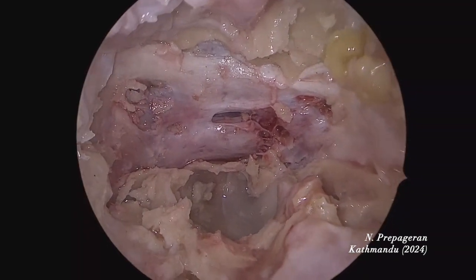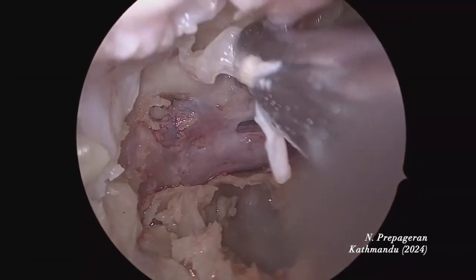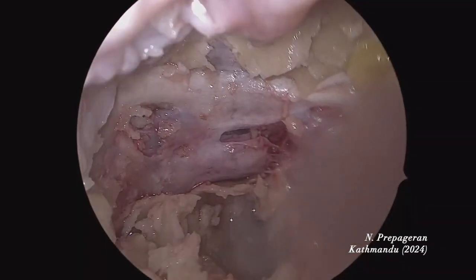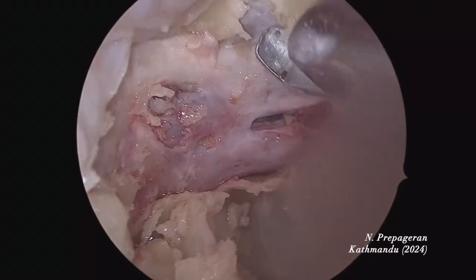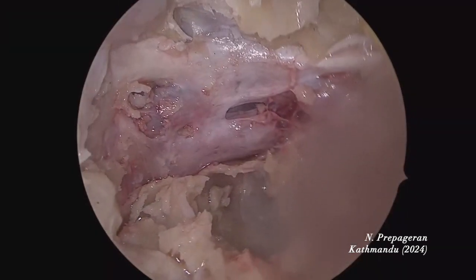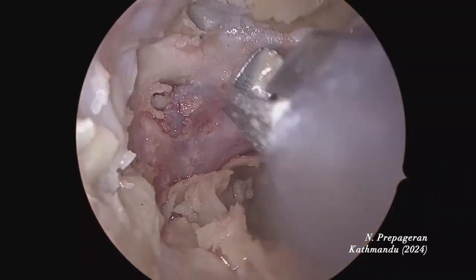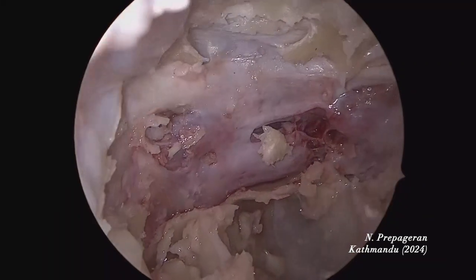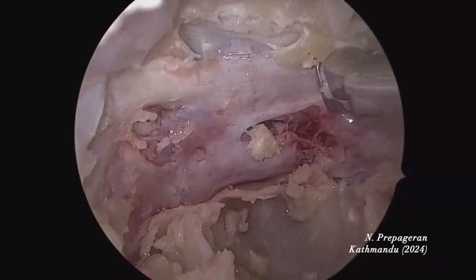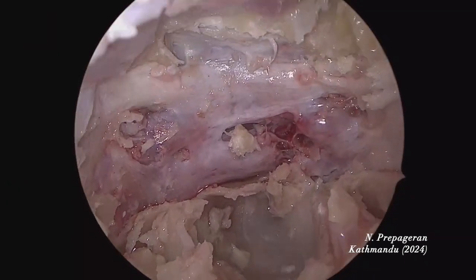Let's go up and expose the planum a little bit more. This is the easiest part. The only issue with planum is it's a sloping bone, which makes it a little more difficult. But with a nice Kerrison punch you can expose it very nicely. Planum is exposed — can you see?